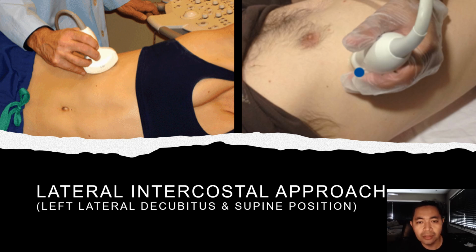When the transabdominal approach fails, the lateral intercostal approach could also be used, especially in obese patients or in patients with inadequate fasting. I, for one, frequently use this approach. One just has to be mindful of the ribs surrounding the intercostal spaces. You must ensure that the probe is oriented along the intercostal space to image the gallbladder adequately. Intercostal views may be obtained with the patient in the supine or in the lateral decubitus position.